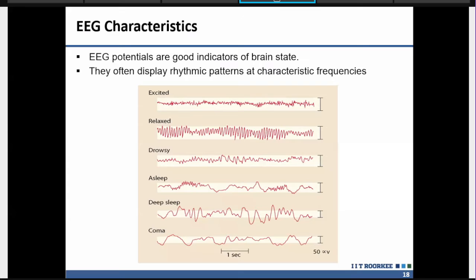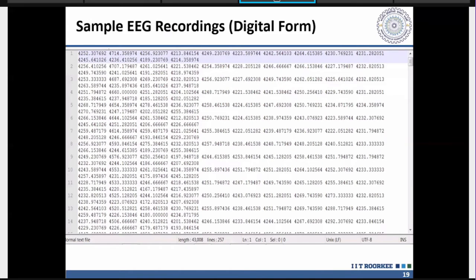So we get the signals and we want to solve some machine learning problems, or use computer-based understanding to help patients. Here we do not need to always go to the doctors. If we collect the data, we can analyze ourselves what the problem is. Or in hospitals also, they can use these kinds of software to detect the disease automatically. So how can we do that?